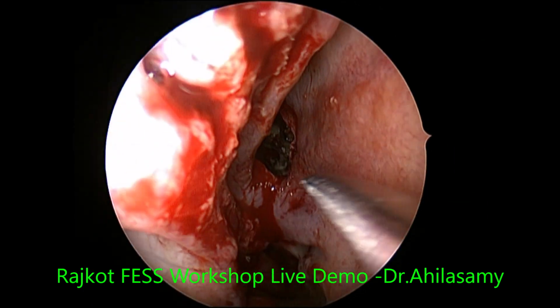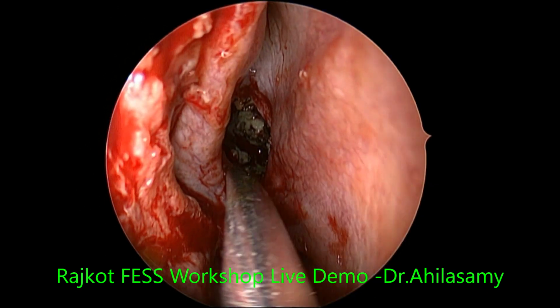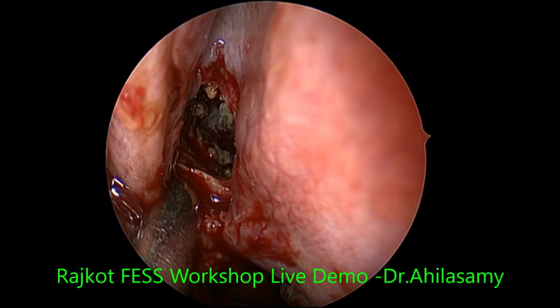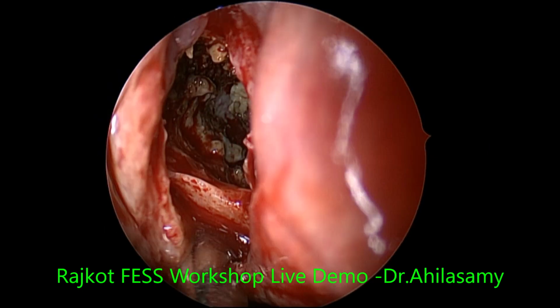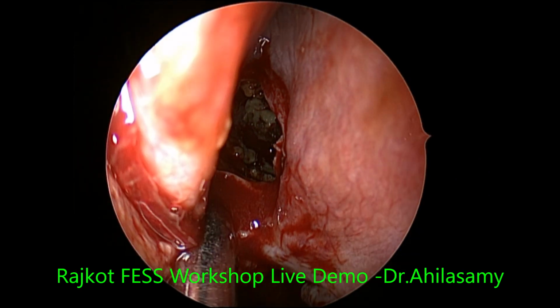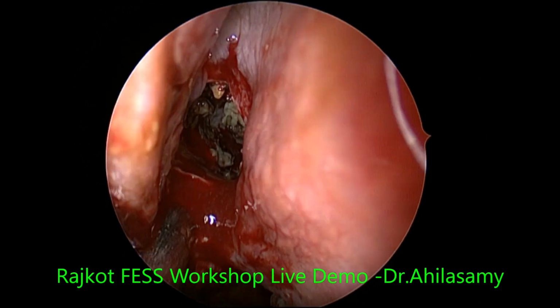See, hello, you just take the mucosa. Mucosa down. Yeah, down, okay. Now give me my Kerrison, to prevent injury to the septal branch. Right, still sometimes it bleeds, okay, no problem. Just right. Give me the Kerrison down. Down.